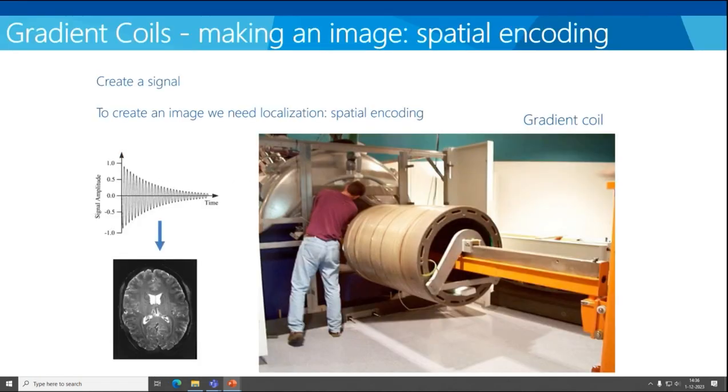Okay, let's go to the gradients. So, why do we use gradients? Who's familiar here with the Larmor or precession frequency? Who has heard that word? Or has not heard that word? Okay. I'll talk to you later then, and then let's talk first.